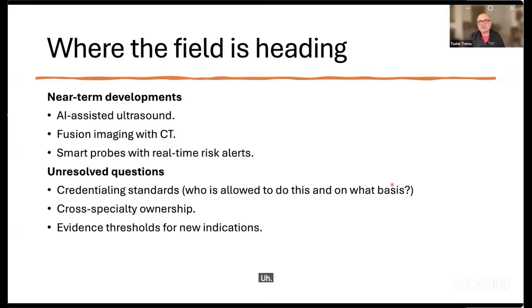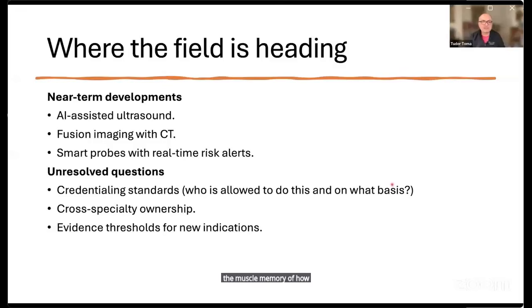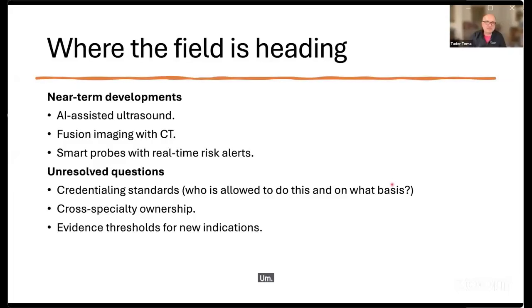I think you still need to assimilate the maneuvers and the muscle memory of how to acquire the image, and therefore a little bit of practice on a simulator after that, or even practice on a patient in a safe environment, is important.